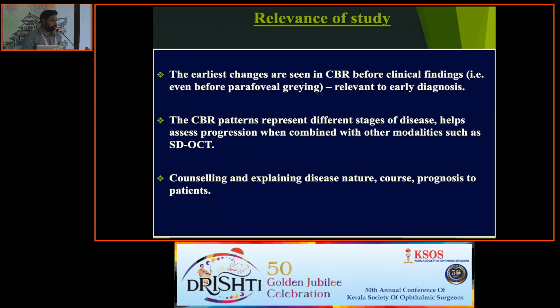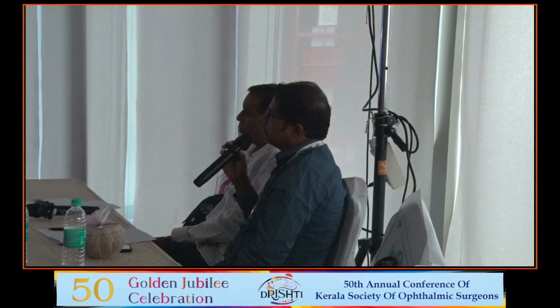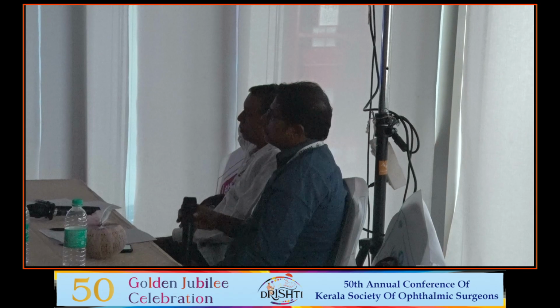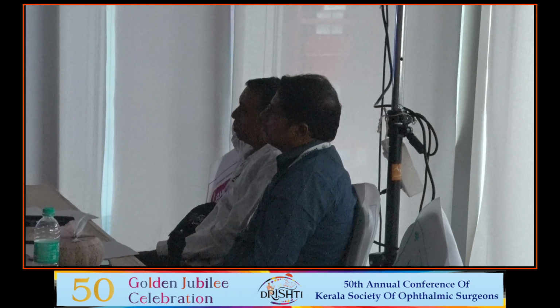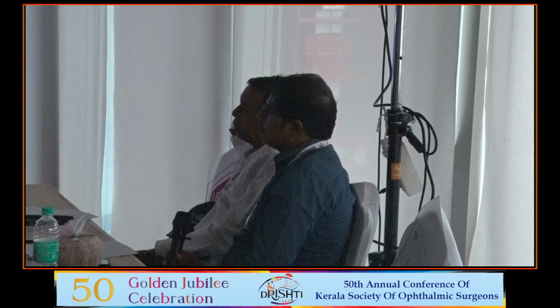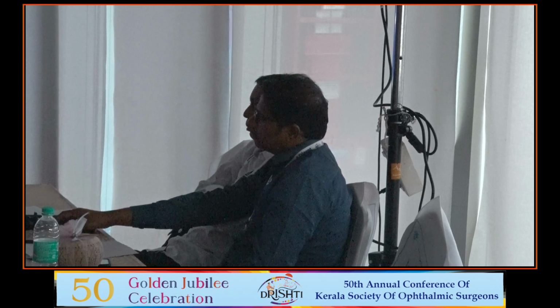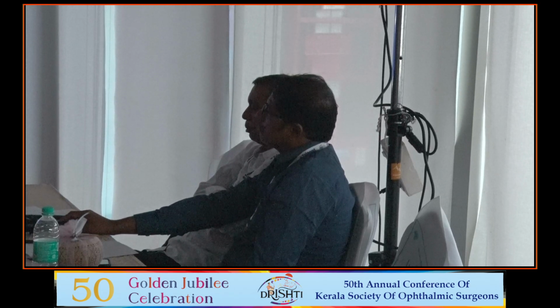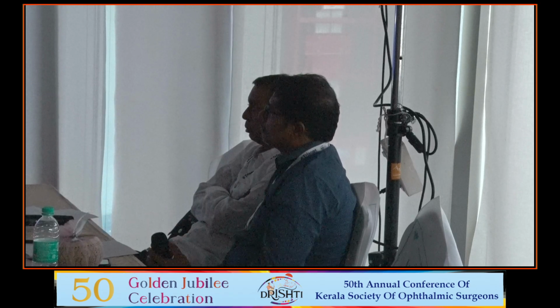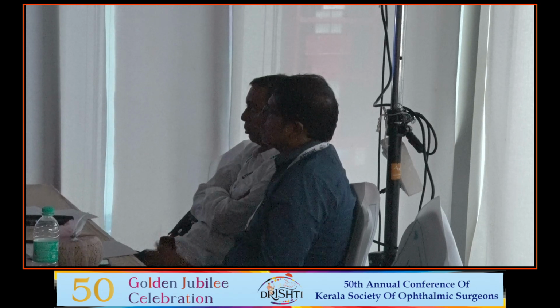Yeah, spectral domain, the Heidelberg Spectralis system. With bleaching, you do not get the same pattern. You need sufficient dark adaptation, around 10 to 15 minutes, for that exact pattern to be replicated. It's usually picked up in Heidelberg because it's a confocal scanning laser ophthalmoscope. Any system which uses a confocal scanning laser ophthalmoscope picks up this phenomenon beautifully, because the blue reflectance also has a small element of autofluorescence. That's why they say that the bleaching phenomenon is affecting the pigments.